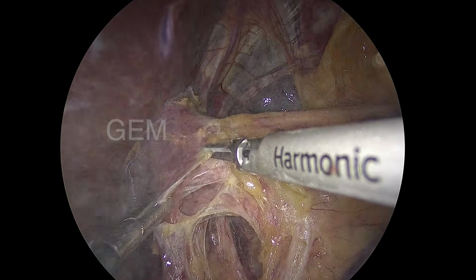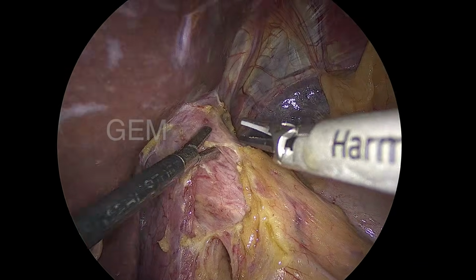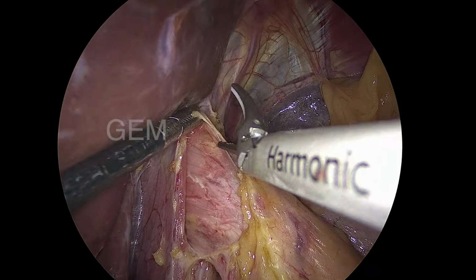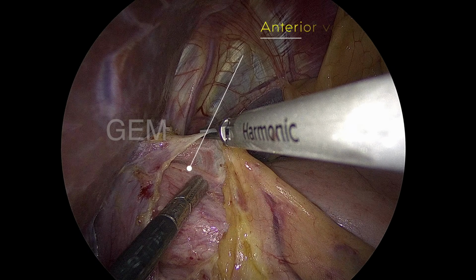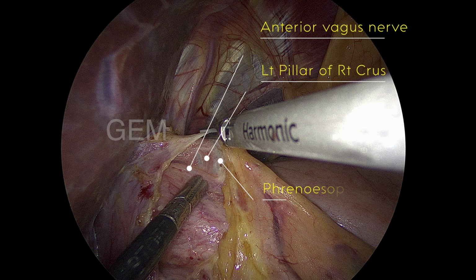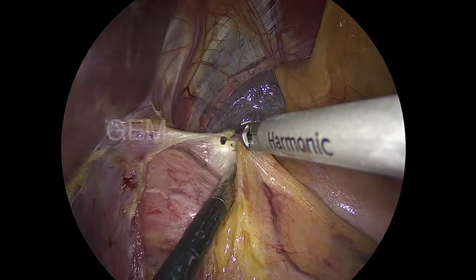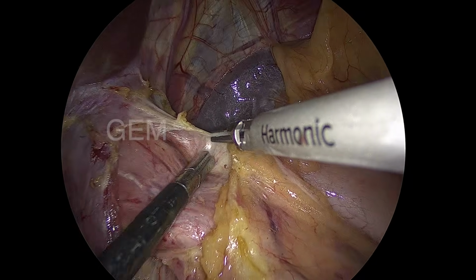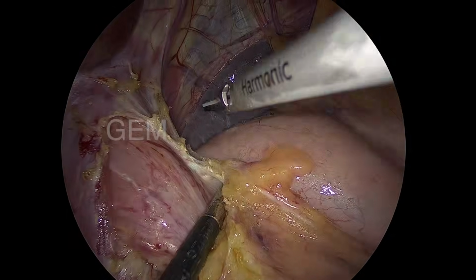So, now I am going to the hiatus. The esophagus is being exposed, and carefully I am pressing down the esophagus. I feel the anterior vagus trunk with my left hand instrument. So, I identify the trunk, the left pillar of the right crus and the phrenoesophageal membrane. The white color is the phrenoesophageal membrane. Once you divide the phrenoesophageal membrane circumferentially, only then can we tell that esophageal mobilization is completed.